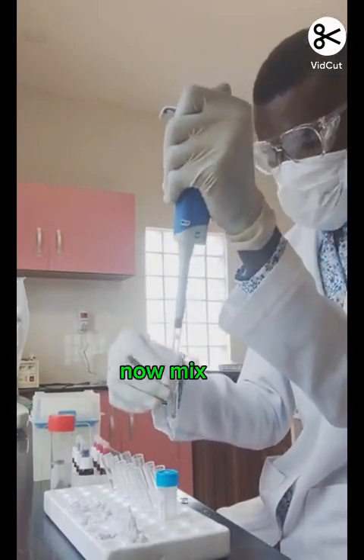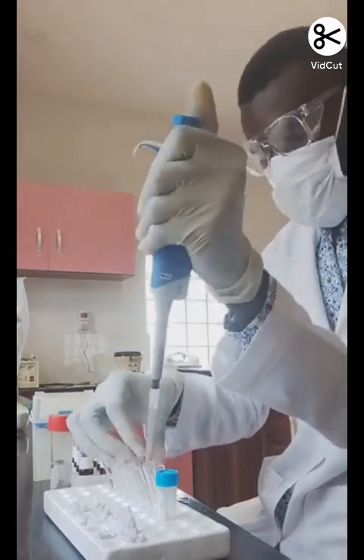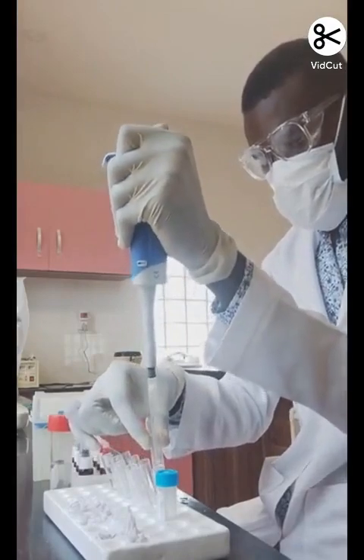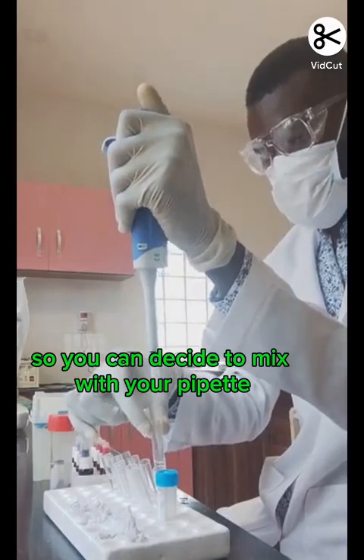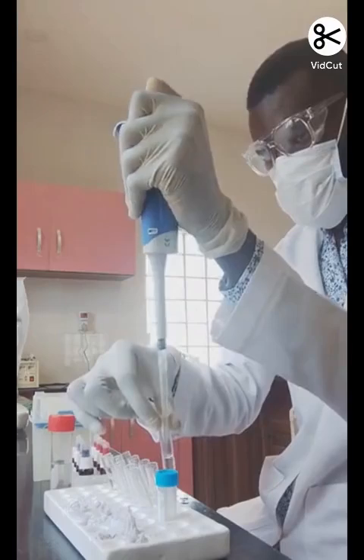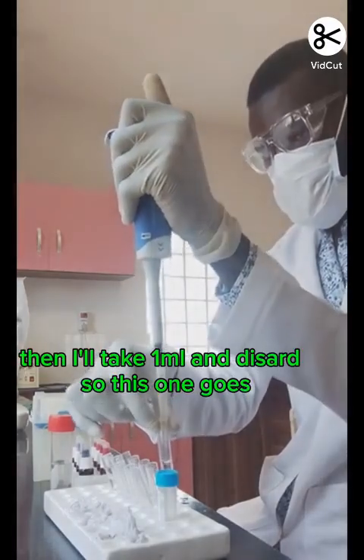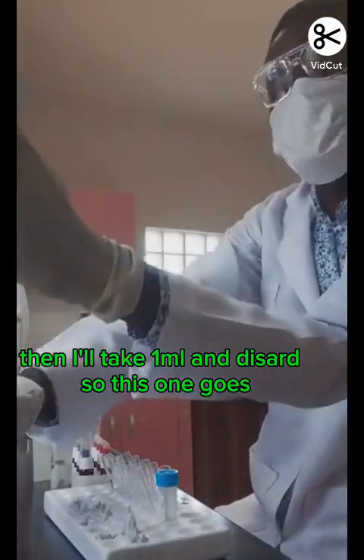I'll mix, take 1 ml. So you can decide to mix with your pipette. Then mix. Then I'll take 1 ml and discard. So this one goes.